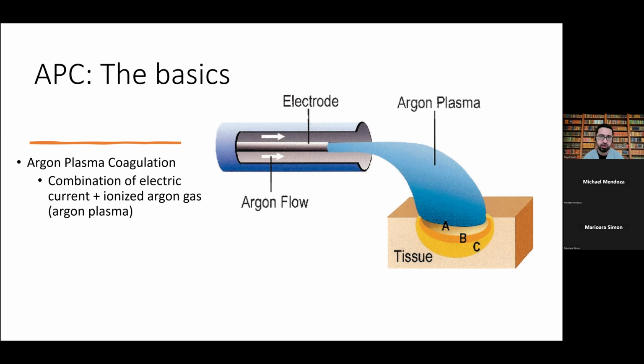So what are we trying to do here? As opposed to using a simple electrosurgical probe or cautery probe, as it's colloquially called, you're using an argon gas that enables you to conduct electricity from the site of initiation where the spark comes to the tissue itself.